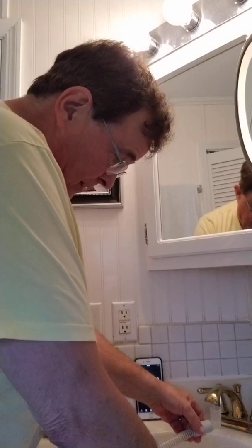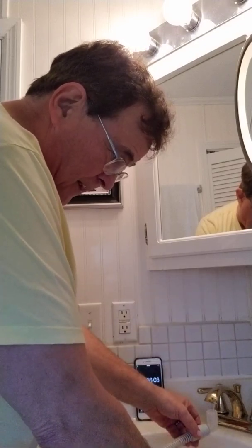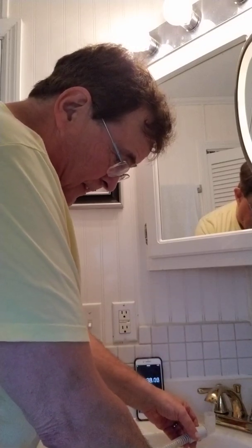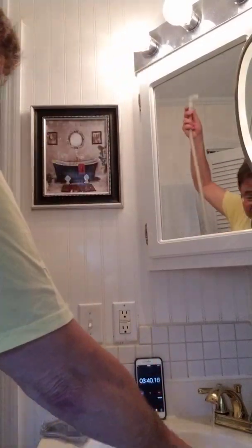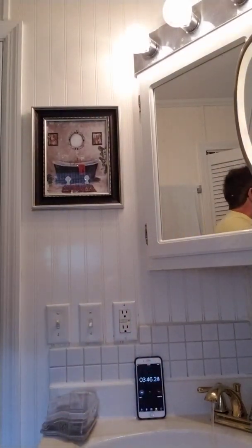And here comes the second one. As soon as water comes up through the other end, I'll know that it's full. There it is. And so it just, again, goes right into the sink. Now hang that one up to dry too.